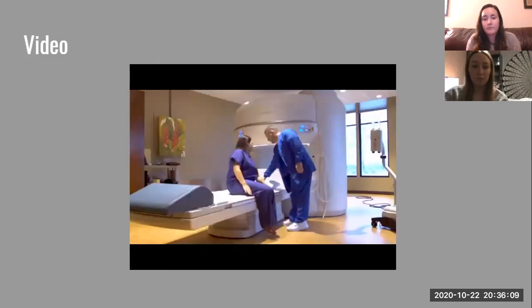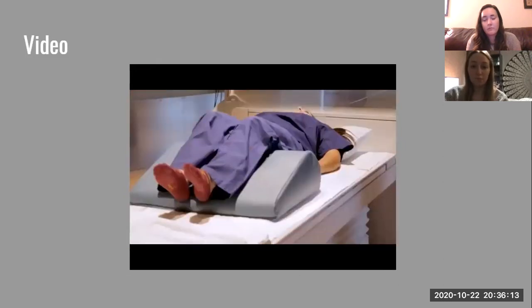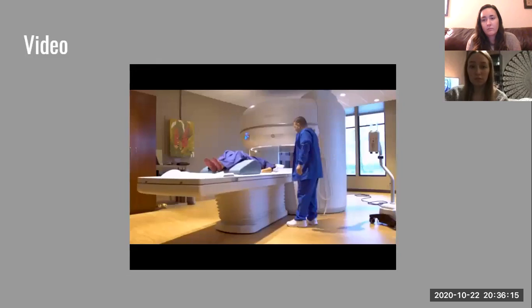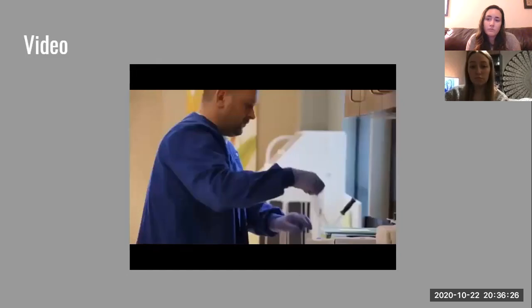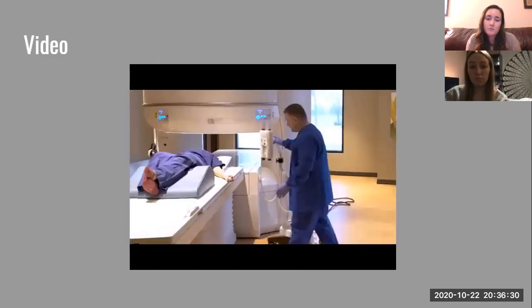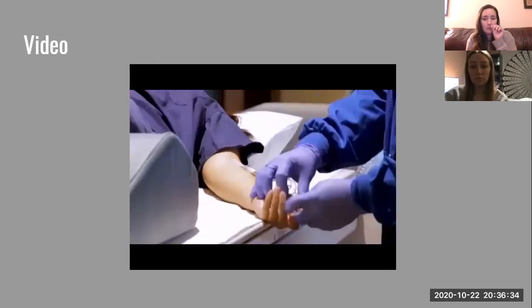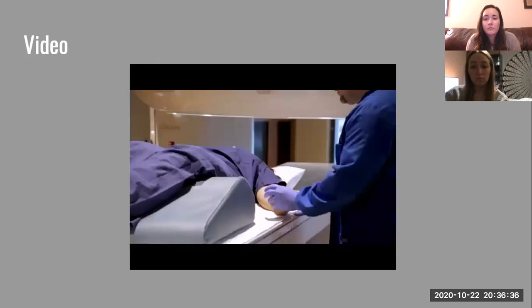When your doctor sends you to get an MRI, there's a chance you'll need to get an injection of contrast material. If we're looking for or suspicious for infection, when we're looking for any type of cancer in any type of body part, giving the IV contrast is very helpful. We can make a much more accurate and quicker diagnosis. If you need contrast, your technologist will put an IV in your arm before you go into the MR machine.